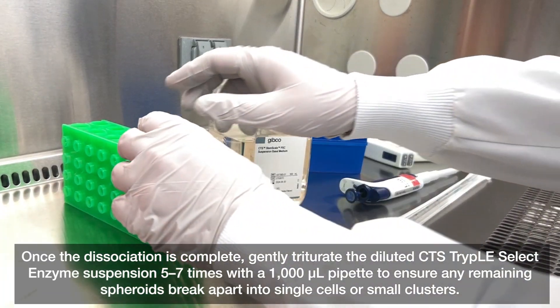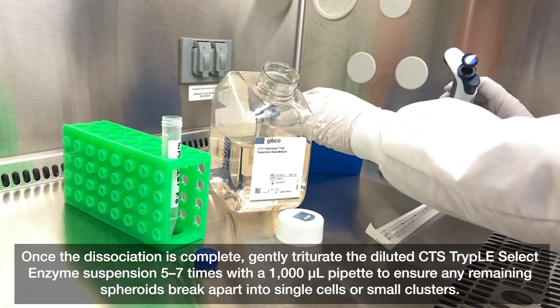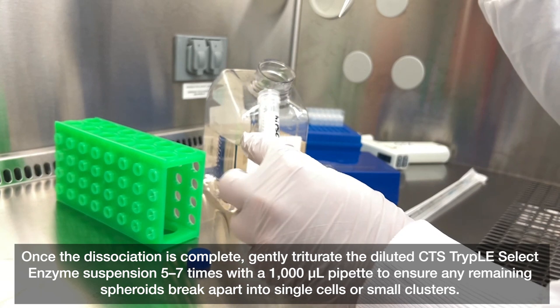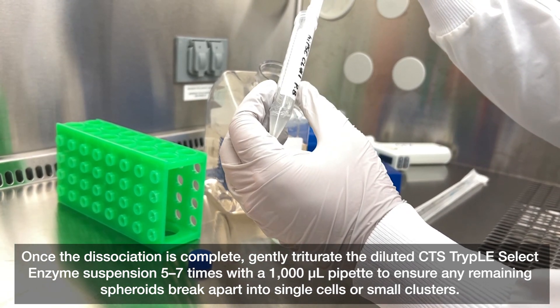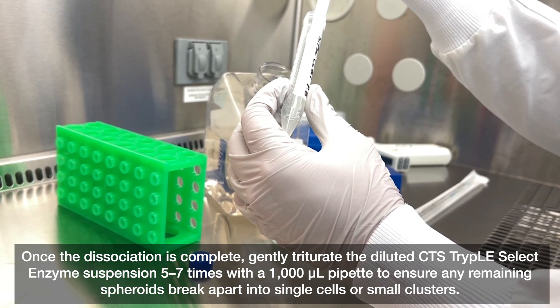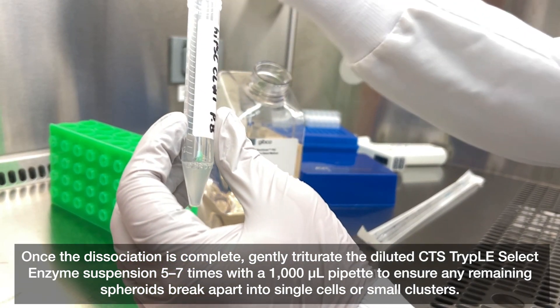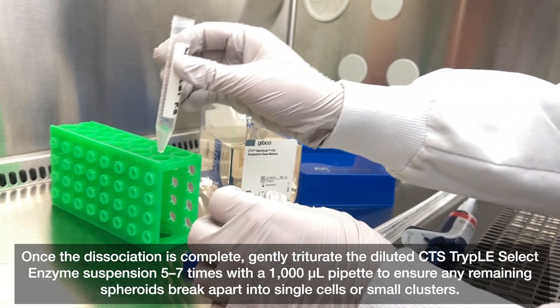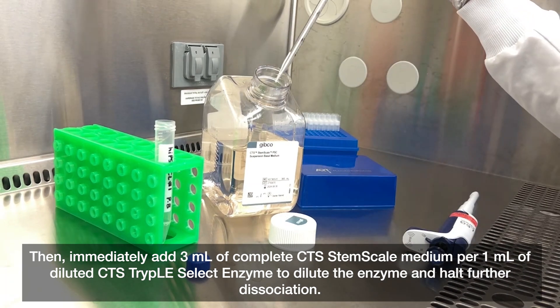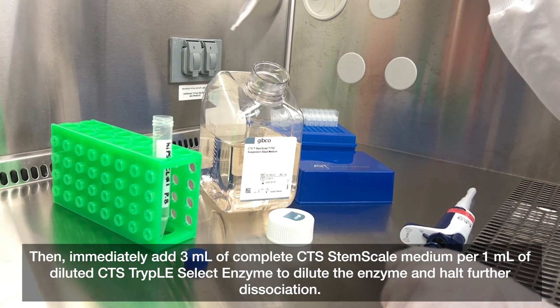Once the dissociation is complete, gently triturate the diluted CTS TrypLE Select enzyme suspension five to seven times with a 1000 microliter pipette to ensure any remaining spheroids break apart into single cells or small clusters. Then immediately add three milliliters of complete CTS StemScale medium per one milliliter of diluted CTS TrypLE Select enzyme to dilute the enzyme and halt further dissociation.